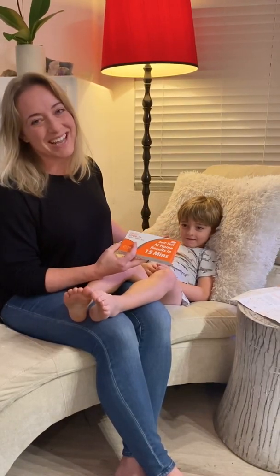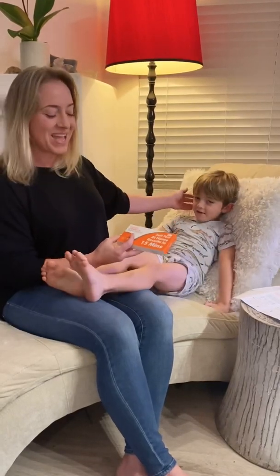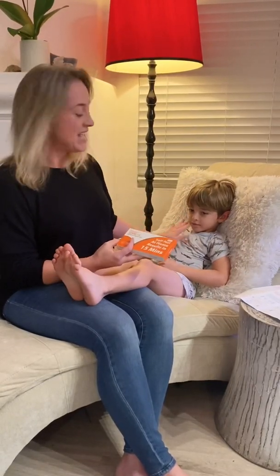Hi, I'm Dr. Natalia Gwynn and I'm going to show you how we do an at-home antigen COVID test with my son.